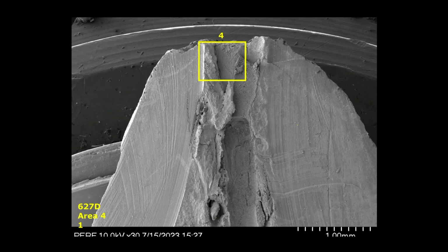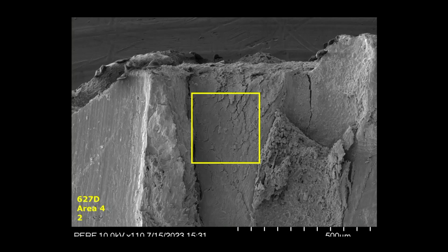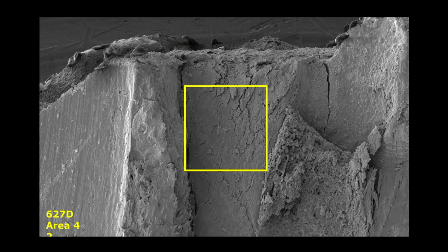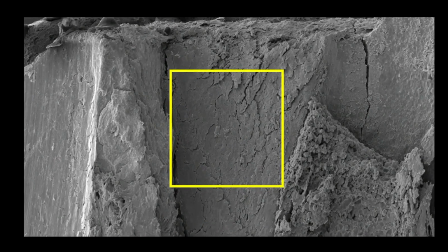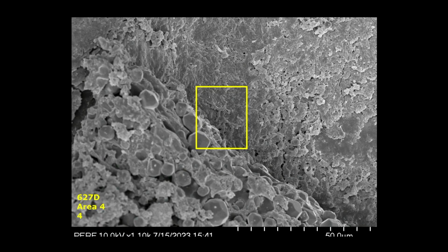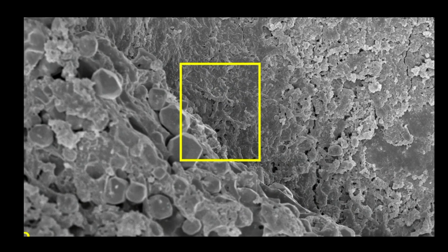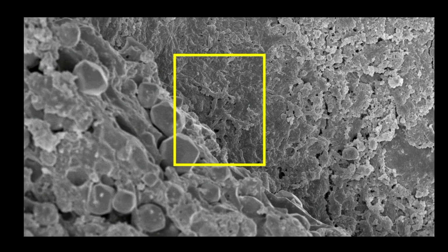And just to tease you with another example, this is Captain Kirk's same case apically. When you go in and look at the terminal part of it, you have a lot of sealer, a lot of debris, but you usually get a chance to look at the mineralization front.